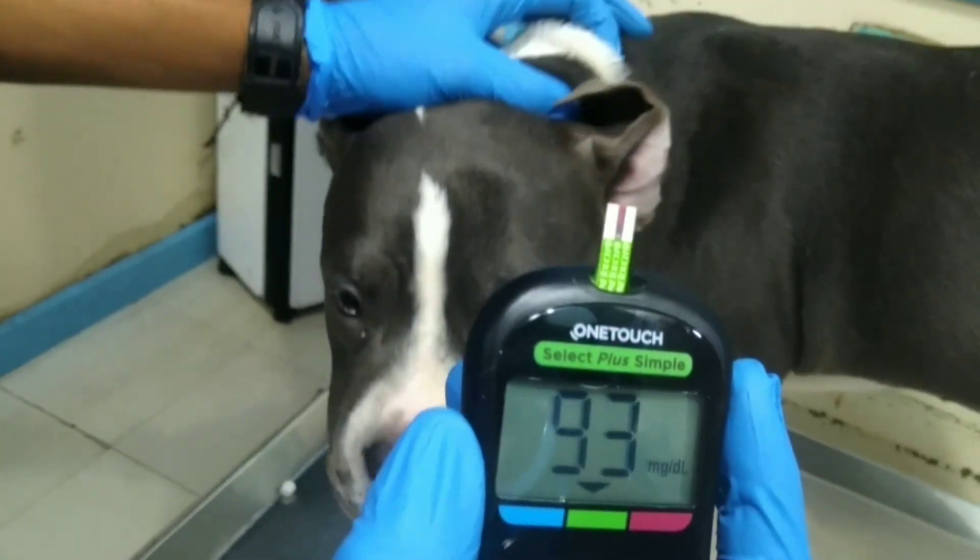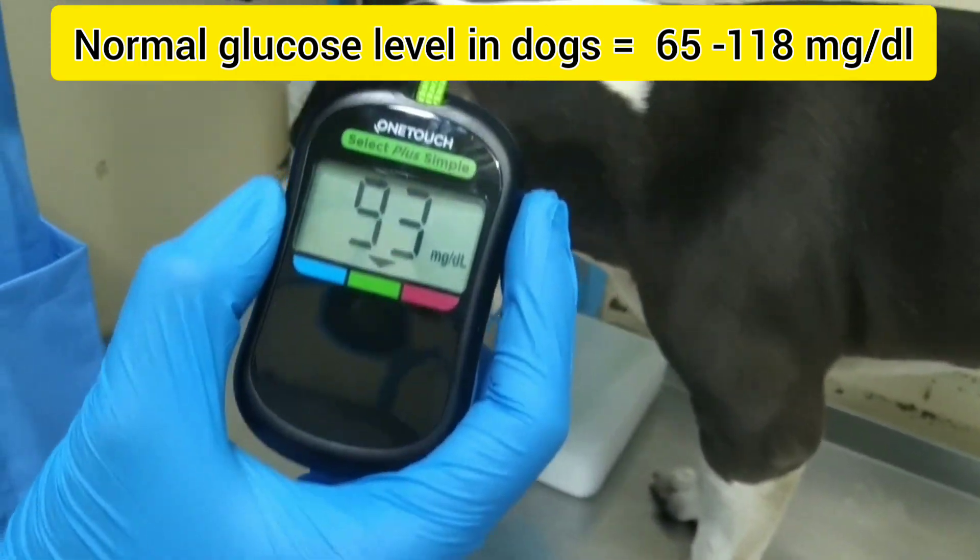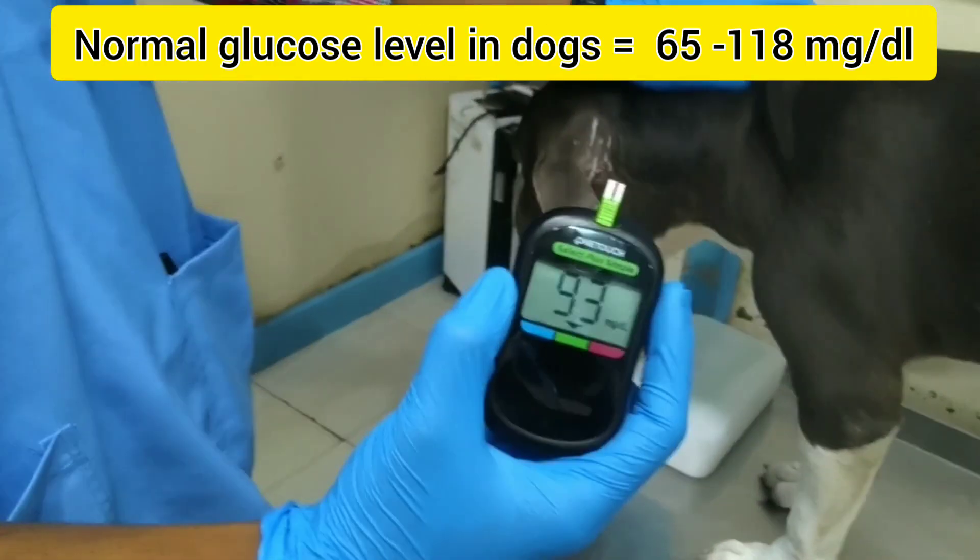The value is 93 mg per deciliter — it's a normal value. The normal blood glucose level in dogs is 65 to 118 mg per deciliter.